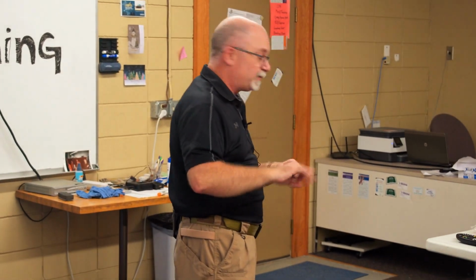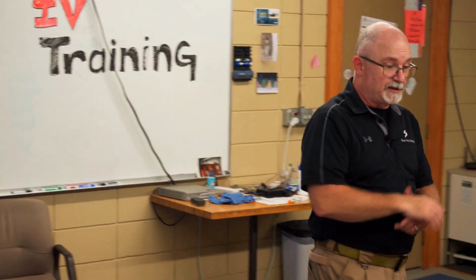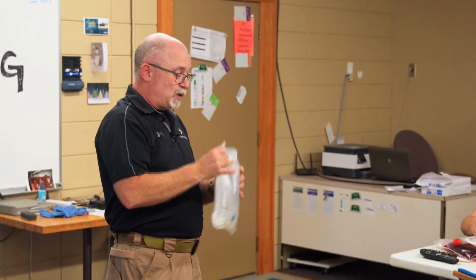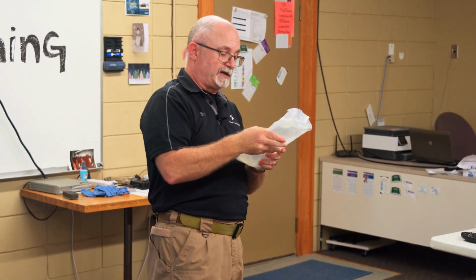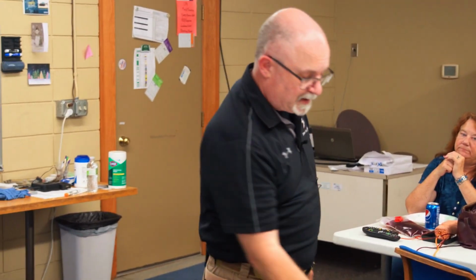So in some of those big cases, we can talk about that in rates in a minute, but there are times in major trauma, yes, you want the access, but you don't necessarily want to pump a lot of fluid in. Because the solutions that we're going to be using, so we'll get into some more of the what, most of you guys watched the video on the various types of solutions. So the one that's most commonly called normal saline or 0.9% sodium chloride injection, and we can list all the ingredients on here, but in essence, this is salt water.